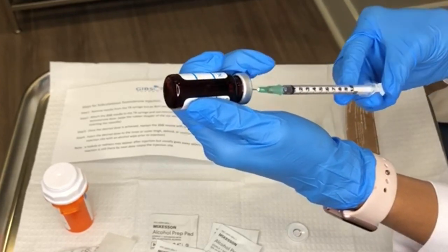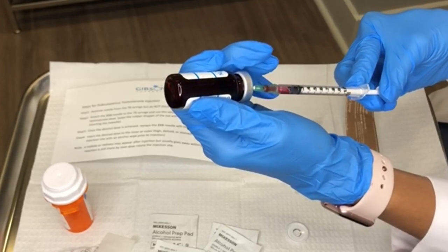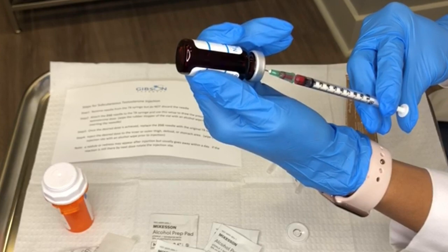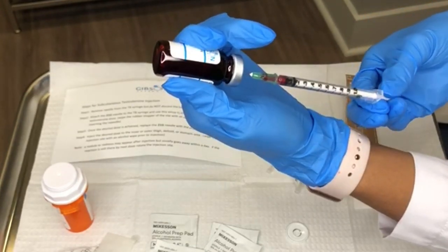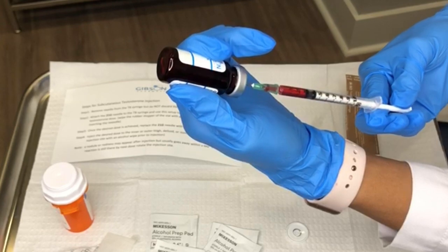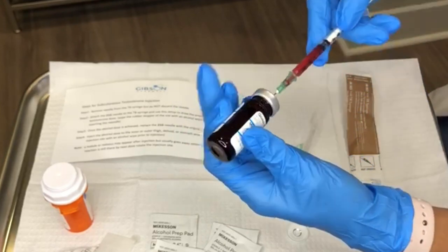At this point you can draw back — make sure that the needle is completely submerged in the medication so you're not pulling air out of the vial. If you have a lot of bubbles, push the plunger and push the medicine all the way back into the vial, then redraw again pulling the plunger back to decrease the amount of bubbles. Draw the medicine out slowly, and if you must, tap the syringe to get the excess bubbles out.